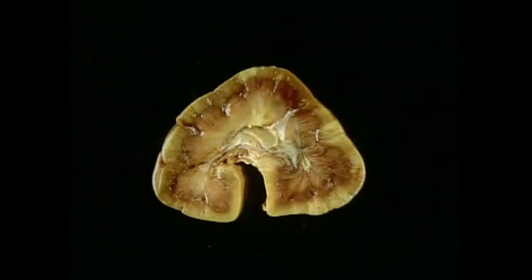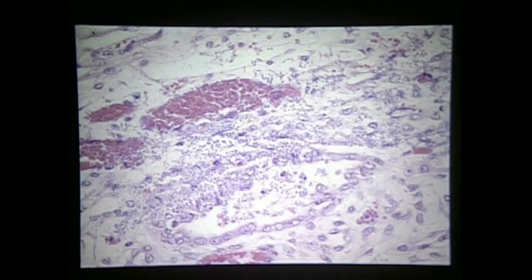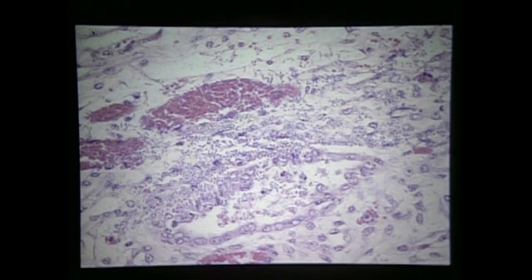A few other examples of infectious causes for nephritis. Here is a set of kidneys to show various foci in the cortex. This was a case of nocardiosis. The next one was a case of candidiasis in an immunocompromised Arabian foal, whereupon the yeasts were very plentiful with very little inflammatory response, especially stained, the clusters and packages and foci of yeast deposition throughout the medulla are well presented here.